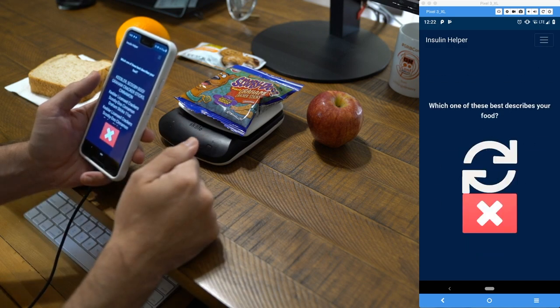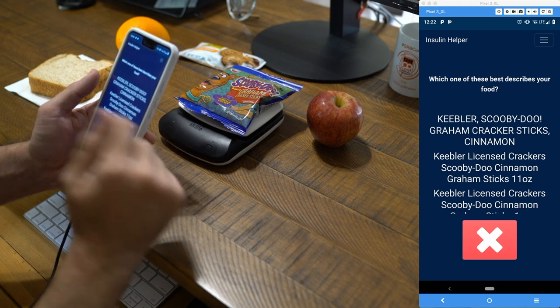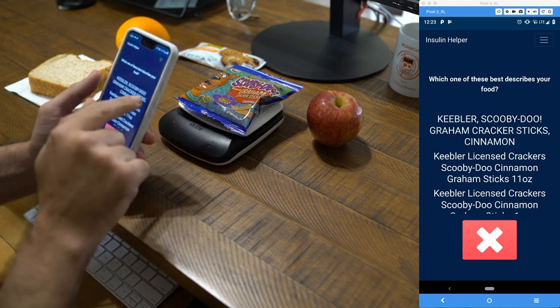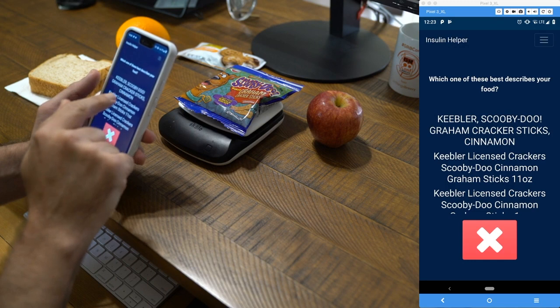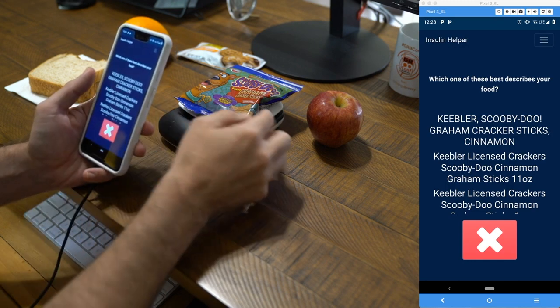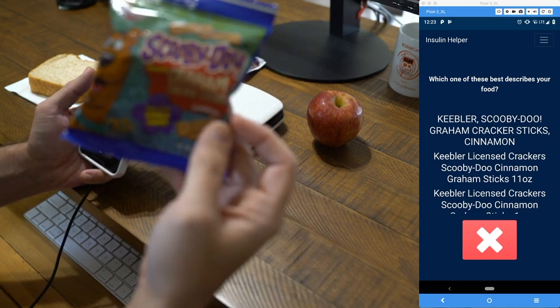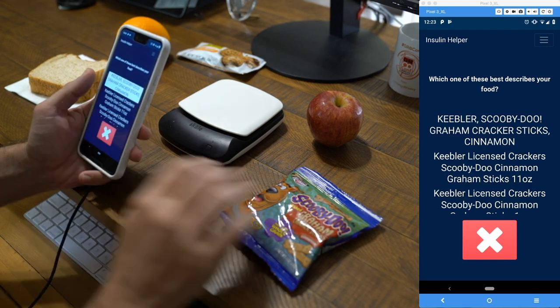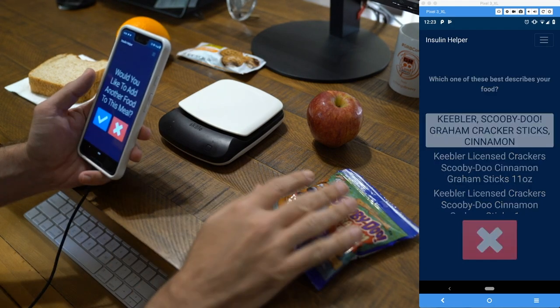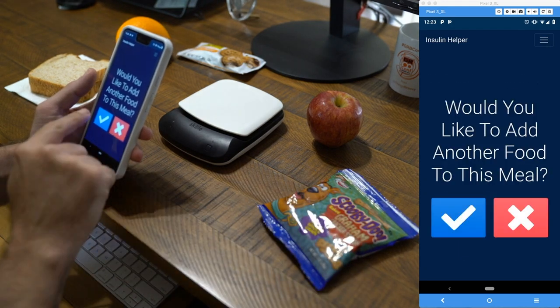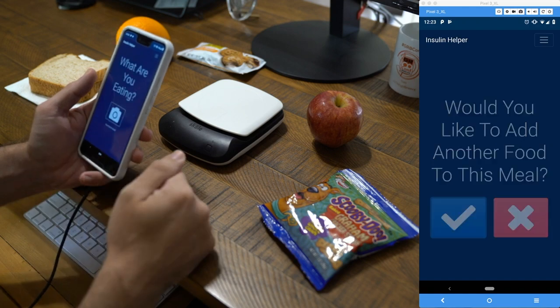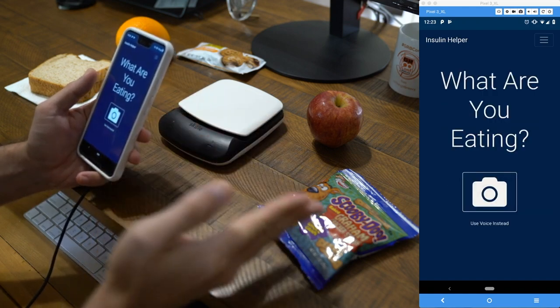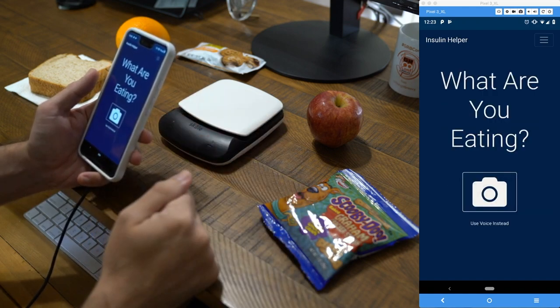It asks which of these best describes the food, and the first option is 'Keebler Scooby-Doo graham cracker sticks, cinnamon' — exactly what we're eating. We confirm that. It asks if we want to add another food, and sure, because we're probably eating lunch. So we have our apple and our graham cracker sticks.